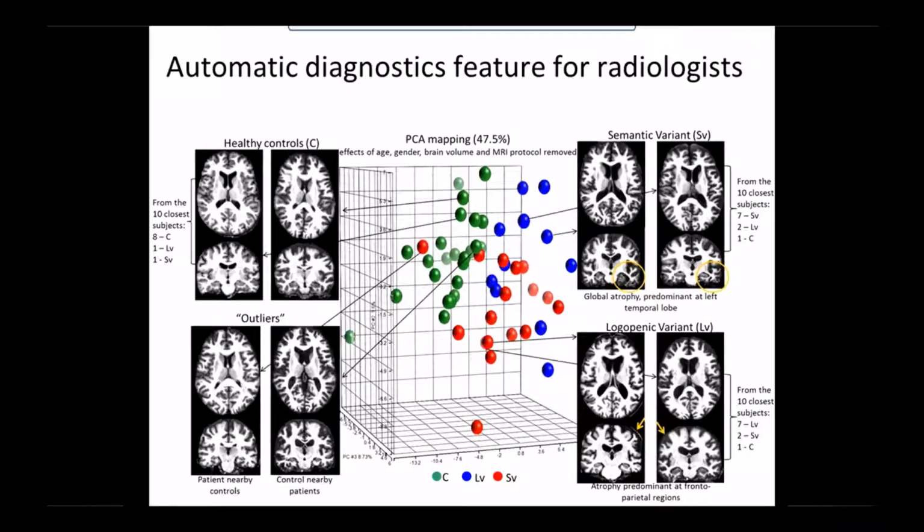So we're using this for training, and we're trying to see if this is a value proposition. What that does is bring up other similar cases, and since they were training data, you have available all of the clinical record from very highly trained, more senior radiologists that have worked over the last 5 years in the clinic and seen rare cases, so you'll see things that are similar and rare. Also, we're investigating whether this is a value proposition to assist in diagnosing.